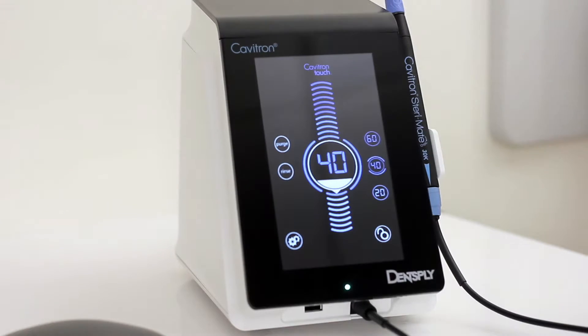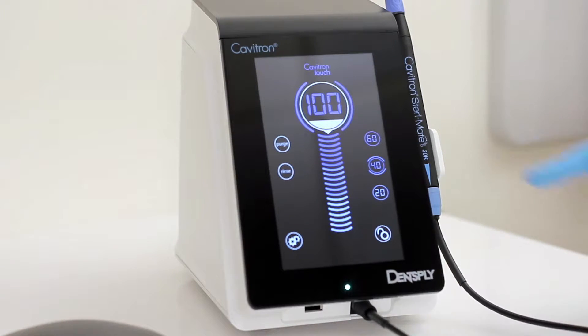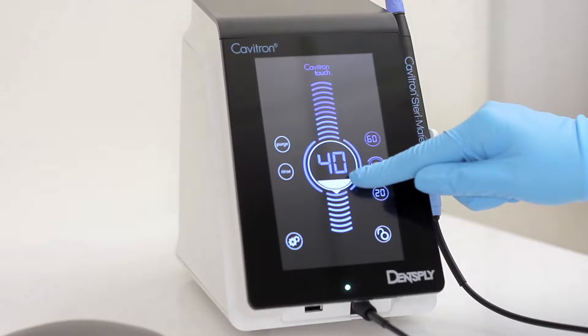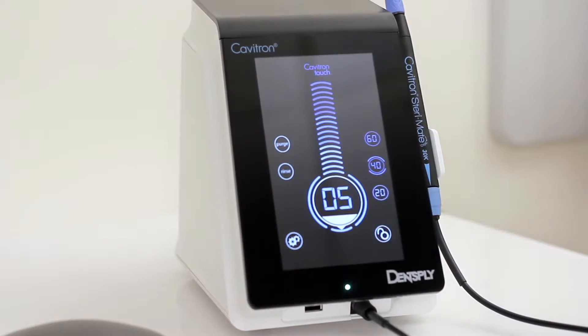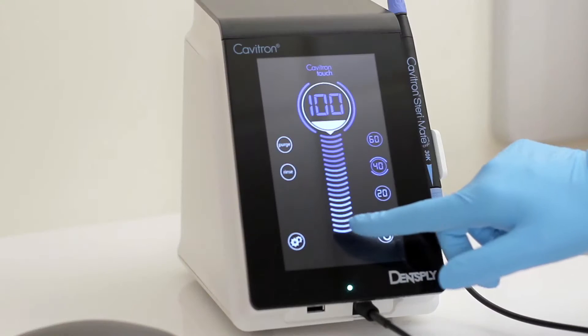The center of the screen contains the power level control. The number displayed in the bubble indicates the percentage of maximum power, ranging from 5 to 100 and increasing or decreasing in increments of 5 when it is held and slid up or down. The power level can also be selected by touching the scale either above or below the bubble.